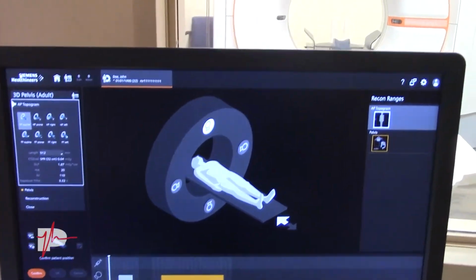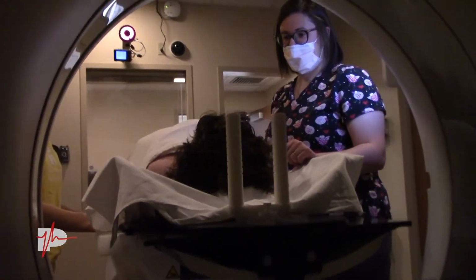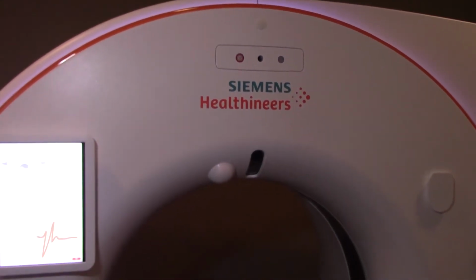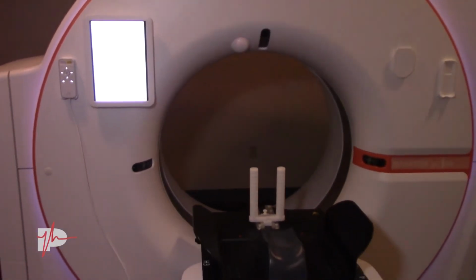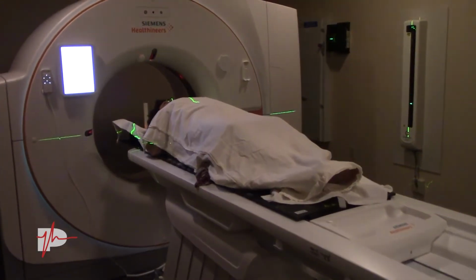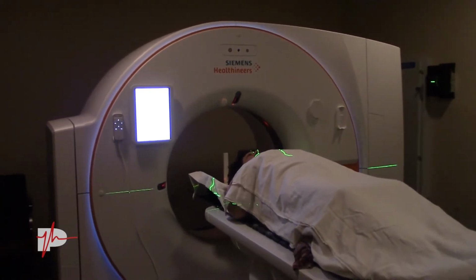Our old CT scanner had a small bore, and what that means is the bore is actually the circle opening on the scanner, so when the patient is moving in on the table, they're moving through that bore. So with the increased bore size, it will help accommodate many more physiques and body builds, therefore increasing patient comfort on the scanner. And having increased patient comfort will help us produce an accurate and reproducible setup, therefore helping the clinical team create a plan that minimizes the dose and damage to the healthy tissue and organs at risk and everything surrounding the tumor, while maximizing the dose to the tumor.